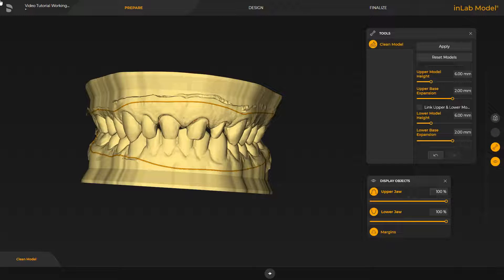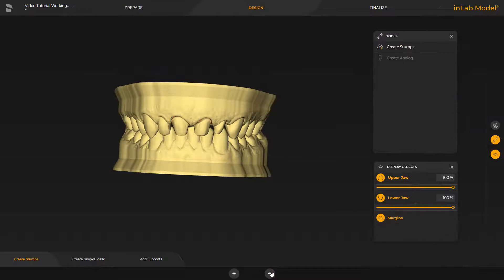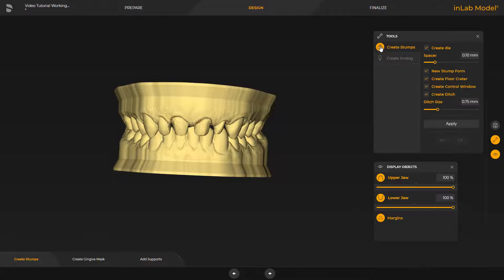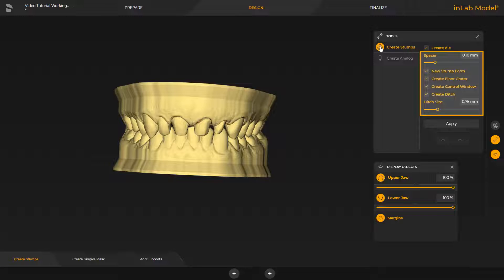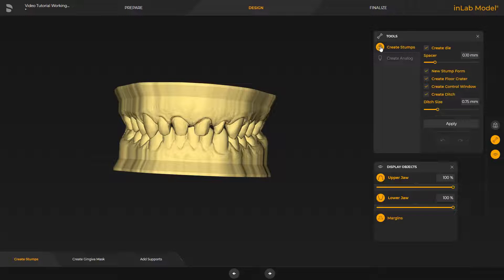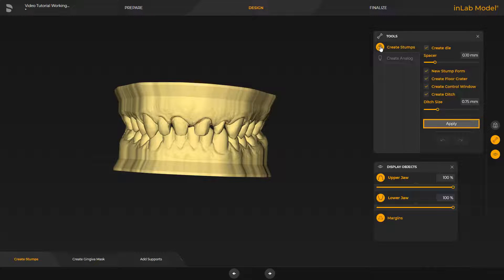We now switch to the next phase, the Design phase. The Create Stumps step offers the option of letting the software calculate stumps by enabling the tool of the same name. Here, too, different parameters or options can be enabled by applying a checkmark. In our case, we decide for the new stump shape in the InLab Model App and initiate its calculation with Apply.